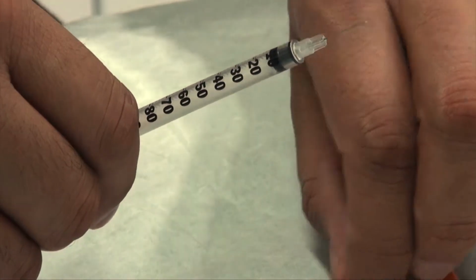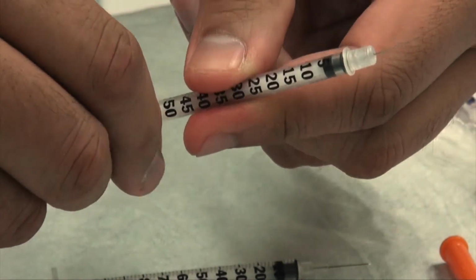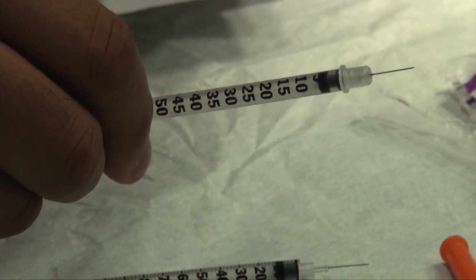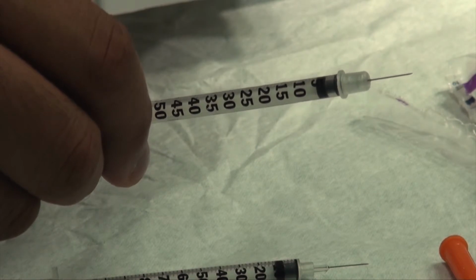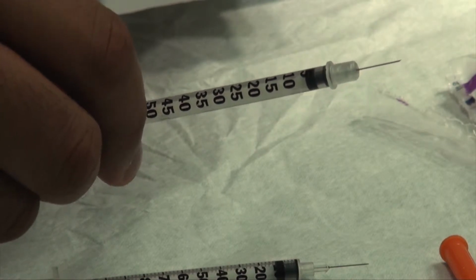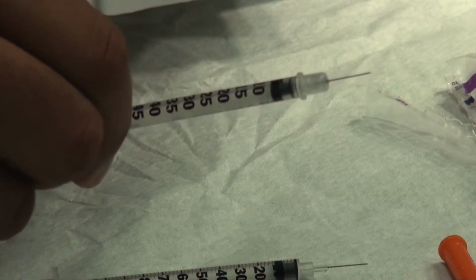If we move now to the 0.5 ml syringe, you can see this also has the same needle, but on a smaller syringe. So the depth of penetration is the same as the 1 ml syringe, and the caliber of the needle, 29 gauge, is also the same. The graduations are, however, smaller, and as a result, you can have finer control over the volume that you are injecting with this syringe.